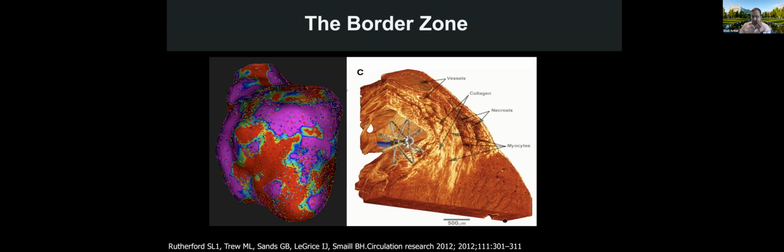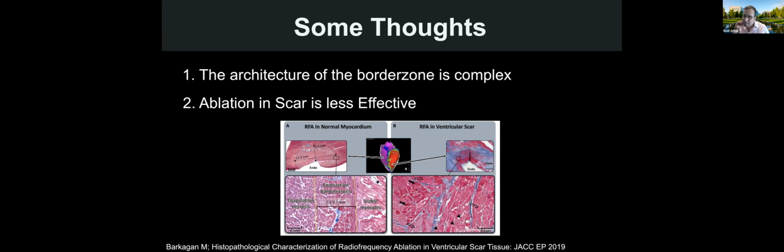There's no better resolution catheter. It's not going to be for a long time. This is what we can get. With this catheter, you get a millimeter or two of information. So what do you really know about this substrate that you really want to so aggressively target? So I am supportive of limited ablation. I definitely see a pro-arrhythmic effect. Sorry, I made this sound for one of the debates with Andrea.